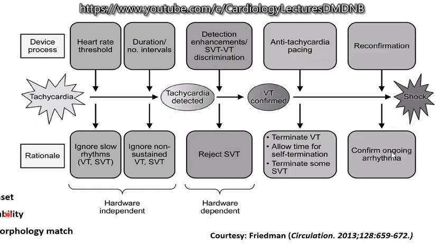Second, a common supraventricular tachycardia in the patients in whom we give ICDs, who are sick patients, is atrial fibrillation, which is an irregular tachycardia, whereas VT is a stable tachycardia. So stability is another criterion. Third, on ECG, what we see is morphology. We always say that if it's a wide QRS or the morphology is completely different from the baseline, we say that it's a VT. So these same three commonest criteria are used by an ICD to differentiate VT from SVT.